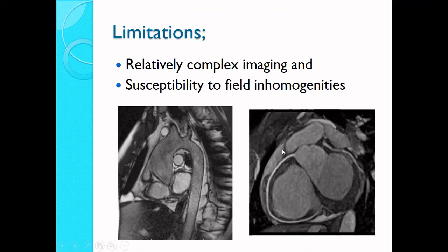Then there is another image which is the axial image of the heart, where you can see that the coronary arteries are emerging from the base of the aorta. So these are very good for assessment as an angiographic tool, because we are doing cardiac angiography mostly based on an invasive technique.